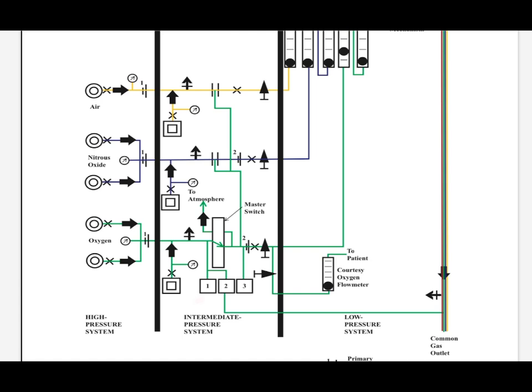So in oxygen there is a power outlet, there is an outlet for oxygen flush directly to the common gas outlet, and we have oxygen pressure failure devices, outlet for oxygen pressure failure devices up to other pipelines as well. We have master switch, as we have discussed, pneumatic component of master switch. Then we have one knob for gases to vent out to the atmosphere. This outlet is used for Mapleson circuits. We can use for Bain circuit.